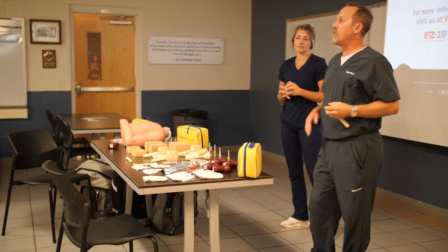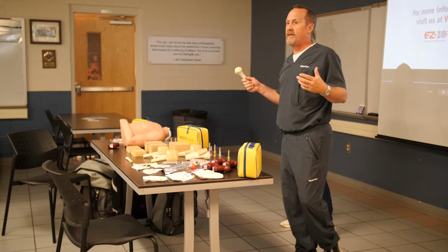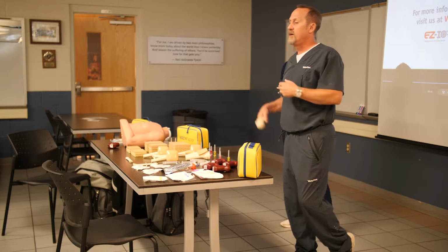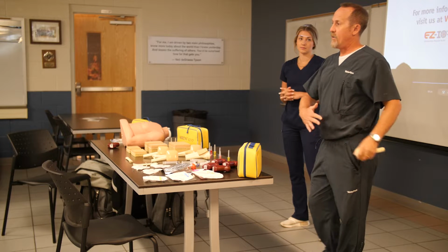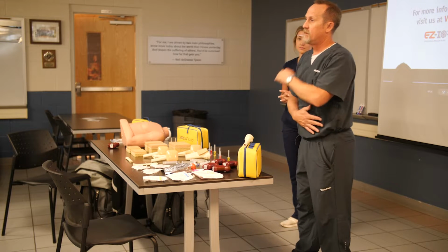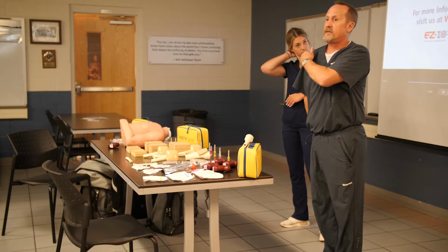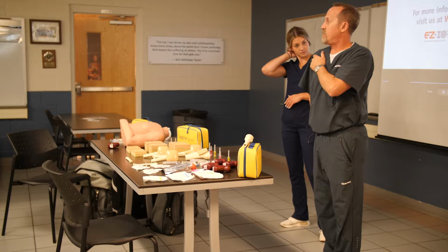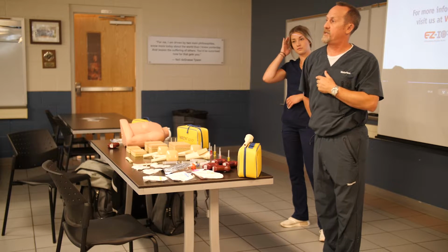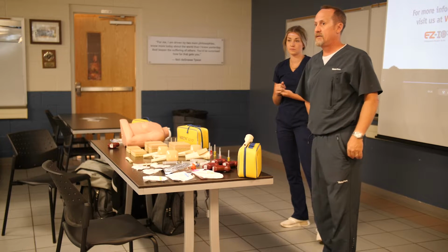So remember, we're dealing with a bone, which I call a non-collapsible, non-rolling vein. It's a permanent structure in there. We can palpate pretty hard in there to find that area that we're going into. But when you have your arm across the belly, I'm still going in right here. If I have my arm across here, it's still the same spot. It doesn't really change the bone. Just when you put your arm to the side, it kind of punches it out a little bit like this. So it's just a little easier to identify. Does that make sense? Yes.